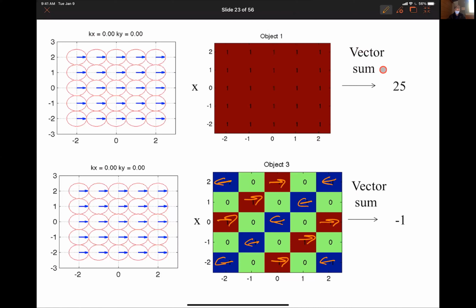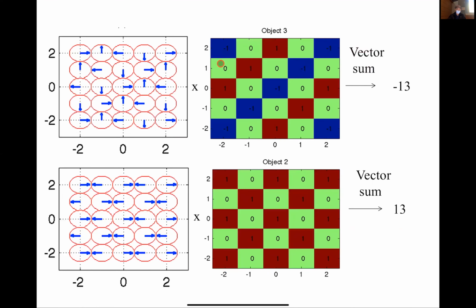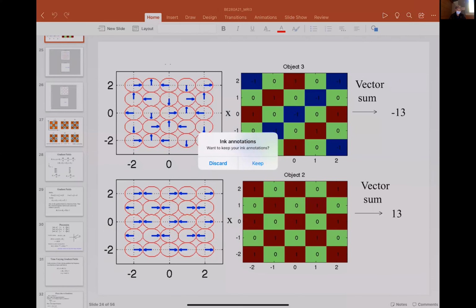And so therefore, if I add all this stuff, it's going to give me -1. And that's because this phasor pattern is not really a good match for this diagonal object, right? Here, if I go out to this component here, right?